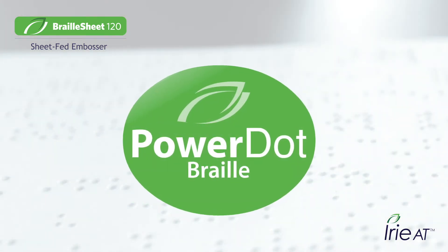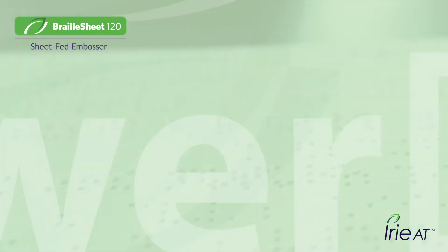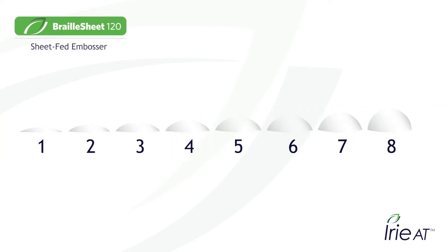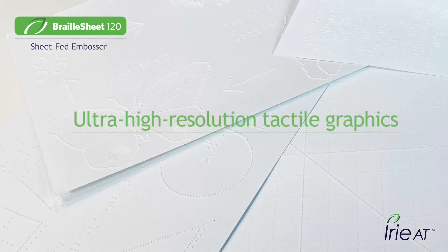Irie Braille Sheet features Power Dot Braille for the best in Braille technology, where you get rounded perfect dots with perfect alignment, shape, and skew. Competing embossers bring you one dot height, but Power Dot Braille allows you to print eight different dot heights on the fly.